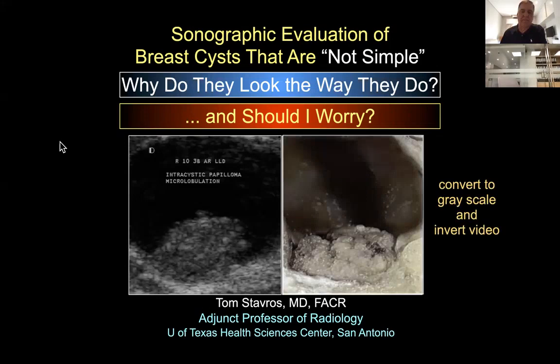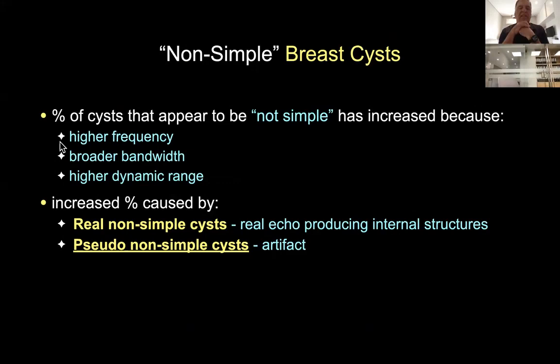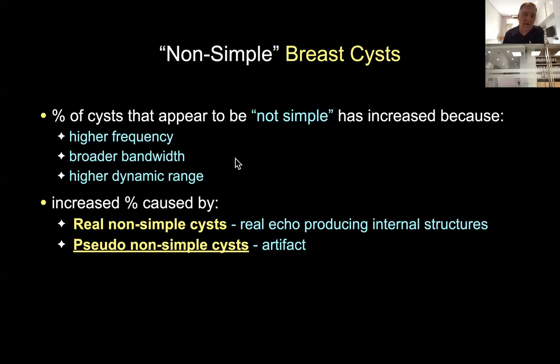The percentage of cysts that are not simple has increased over the past few decades for two reasons. First, better resolution—higher frequency, broader bandwidth, higher dynamic range—allows us to see real benign things inside fibrocystic change. Second, we've pushed scan parameters too far, causing artifact inside cysts. There are technical tricks we can use to minimize clutter artifact within cysts that make them appear non-simple when they really are simple.